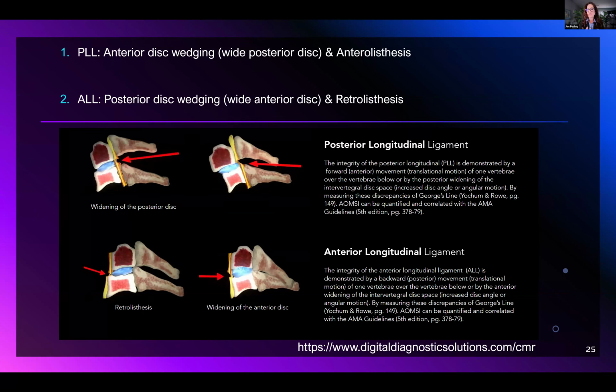Our MRI scans are not thin enough slices. And sometimes when some of these ligaments get torn, they don't show high signal. They just show disrupted fibers or they look more attenuated, which means more black, more thin. That's more of the partial tearing category, but we cannot see that on MRI. And considering something like 70% of injury cases going to an attorney's office happen to be low impact auto injuries or slip and falls that are not super traumatic and ringing the bell, but people are suffering. It causes major suffering in people long term, and the degenerative changes.